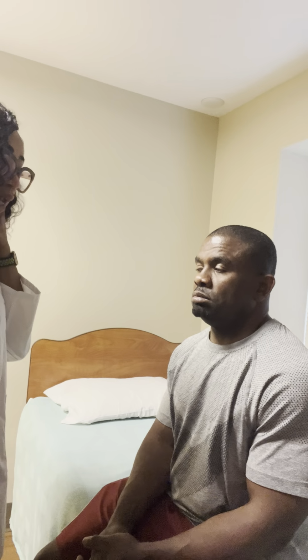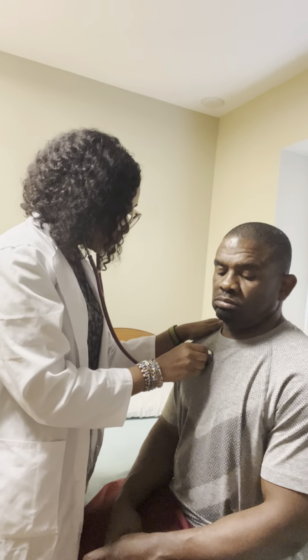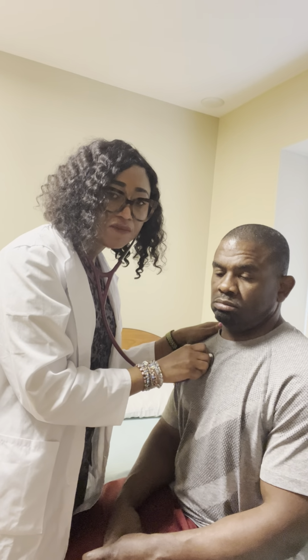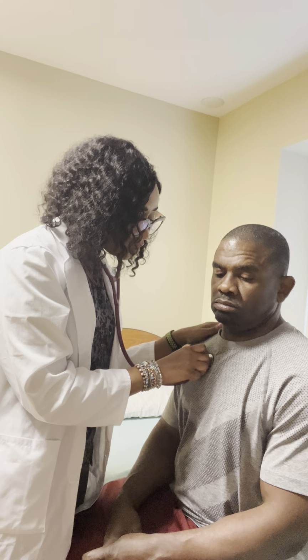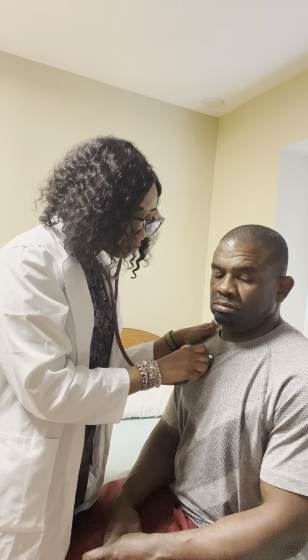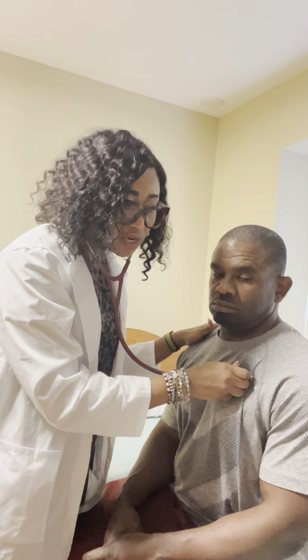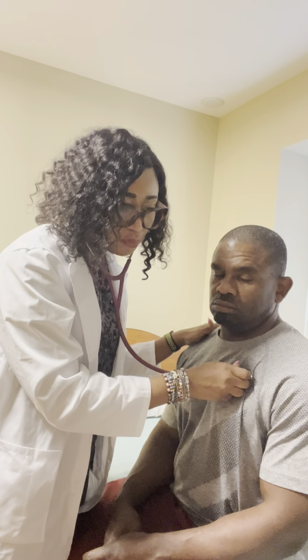And I will go ahead and auscultate for the heart sounds. I will first use my diaphragm and listen. I will start listening from the aortic valve, which is on the second intercostal space to the right sternal border. The pulmonic valve is on the second intercostal space to the left sternal border.